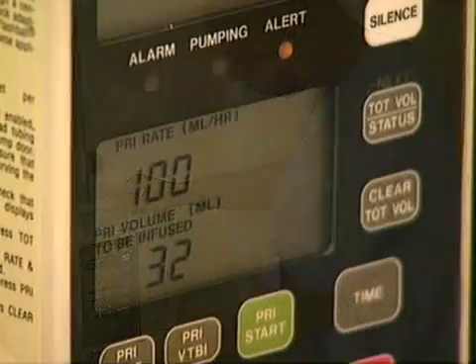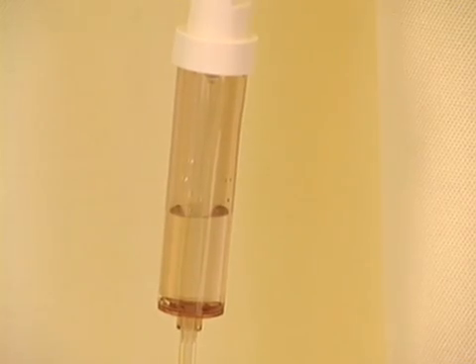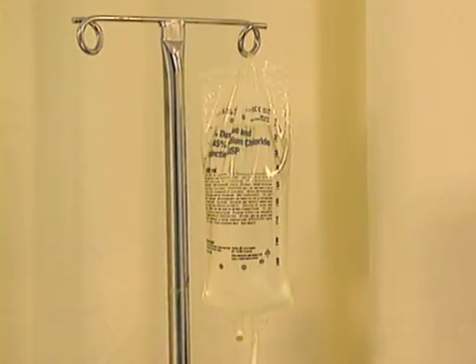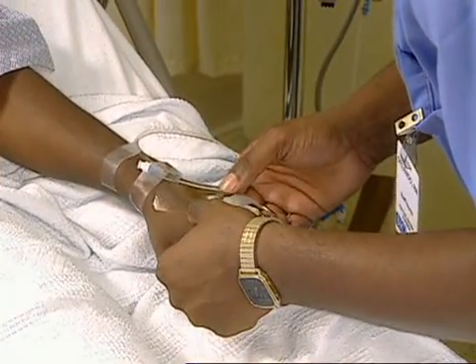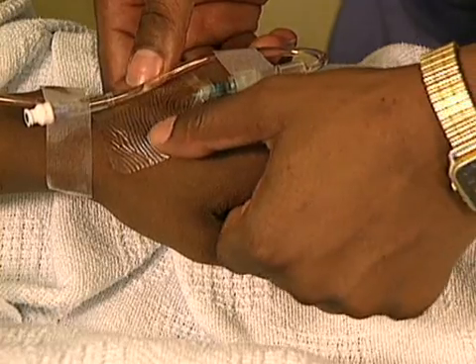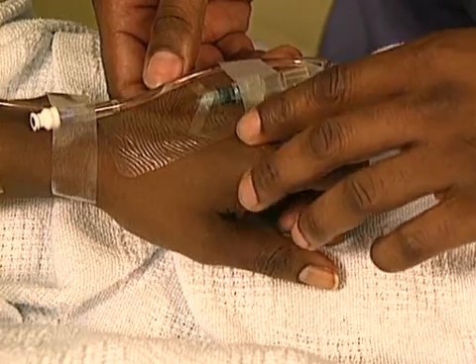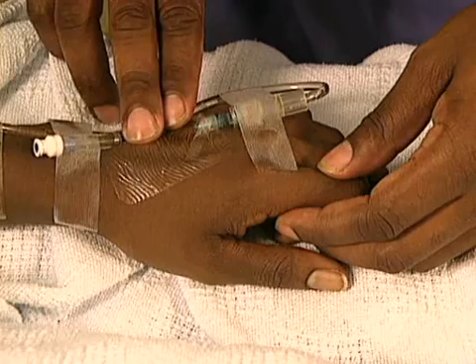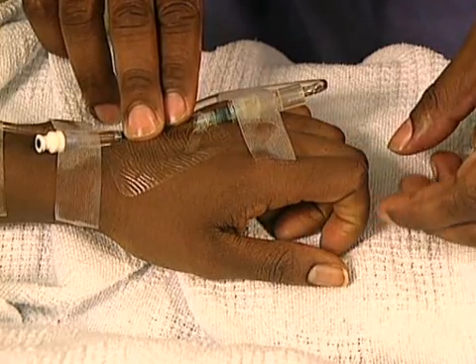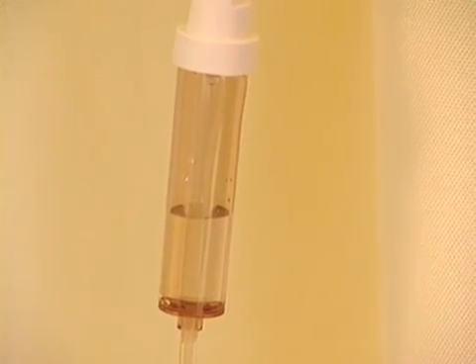The pumps contain various alarm systems that are activated in response to various problems: if the drops are not detected at the appropriate rate, if the solution container empties, or if pressure within the system increases. During each interaction with your patient, assess the IV infusion site to be certain the line is still patent. Gently compress the vein proximal to the insertion site and check to see that fluid ceases to flow into the drip chamber. If fluid continues to flow through the line, assess for infiltration.